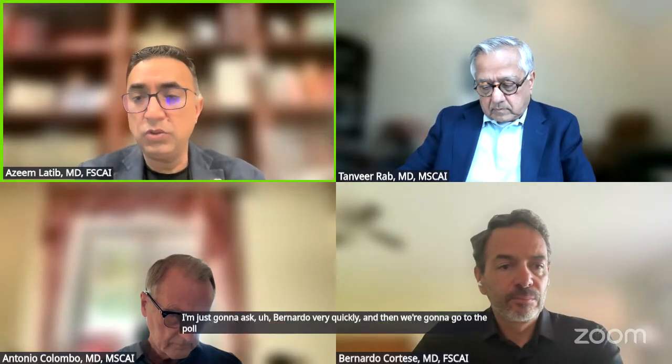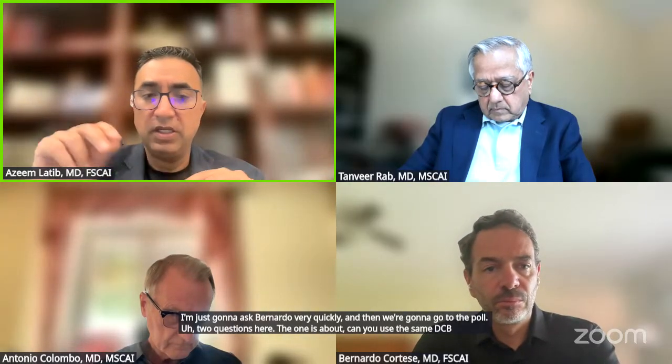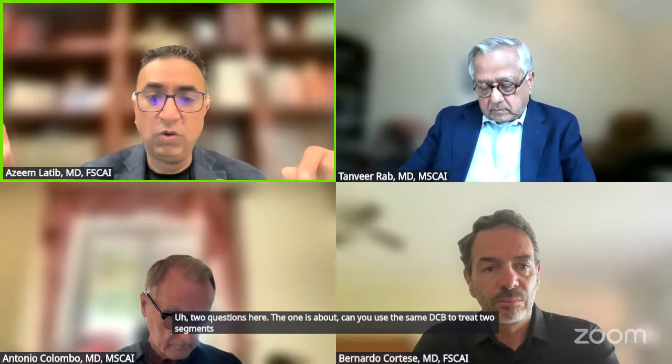I'm just going to ask Bernardo very quickly, and then we're going to go to the poll. Two questions here. The one is about, can you use the same DCB to treat 2 segments in the same vessel? No. Once you use it, single shot, the drug's gone, right?